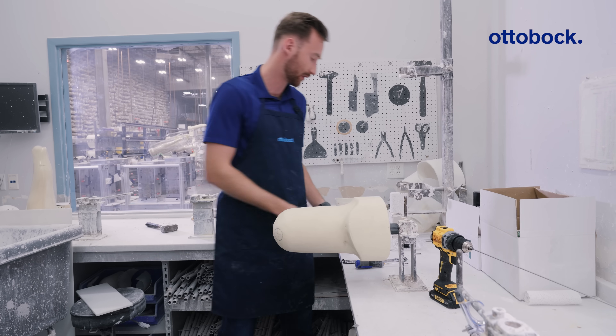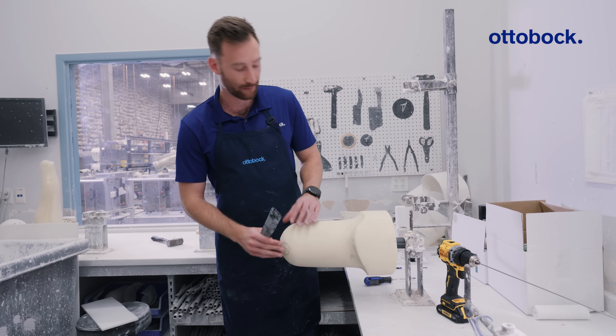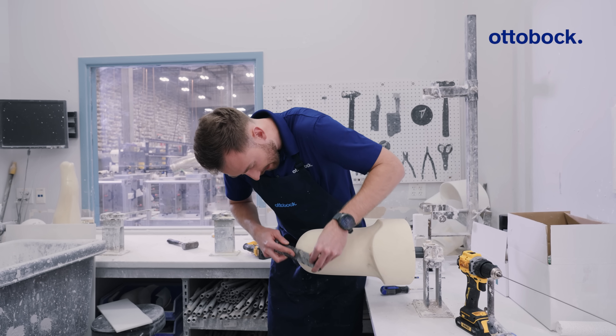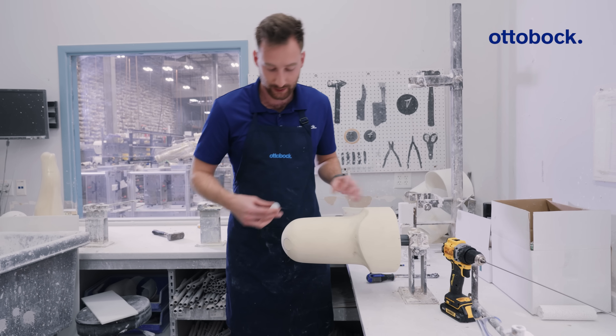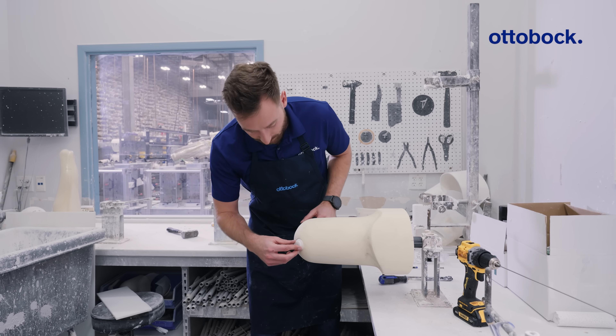Now that I have my circle, I need to take my flat rasp and ensure that I get a nice even flat surface so that this sits flush up against the positive mold. I'm going to lightly shave — it does not take much effort to get a nice flat surface. The process I'm doing here would be exactly the same if you're using a plaster model; we're using a foam model today.